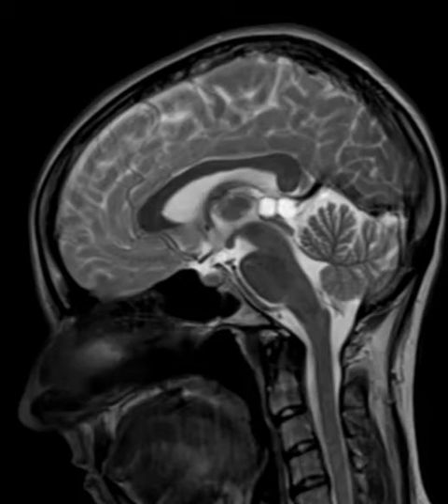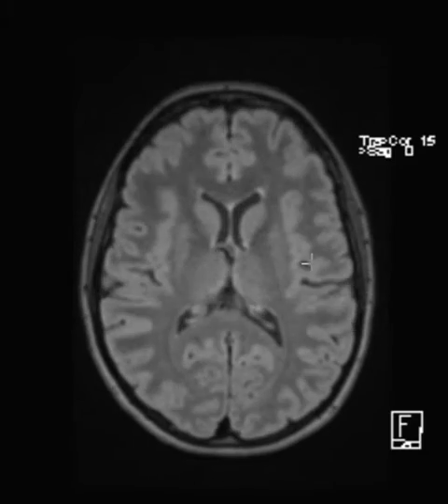Hello, this is Dr. Gay from First Lake MRI, and this is a 30-year-old female with complaints of slurred speech, blurred vision, confusion, disorientation, abnormal fine motor skills. She's got extreme fatigue, difficulty waking up, and other problems. So she's got some very significant clinical problems, but her MRI of the brain looks very good.